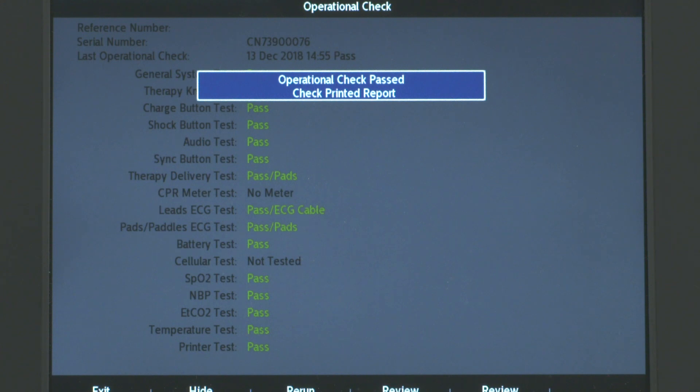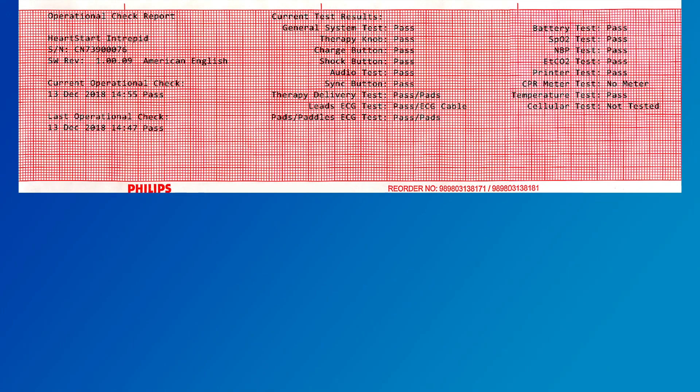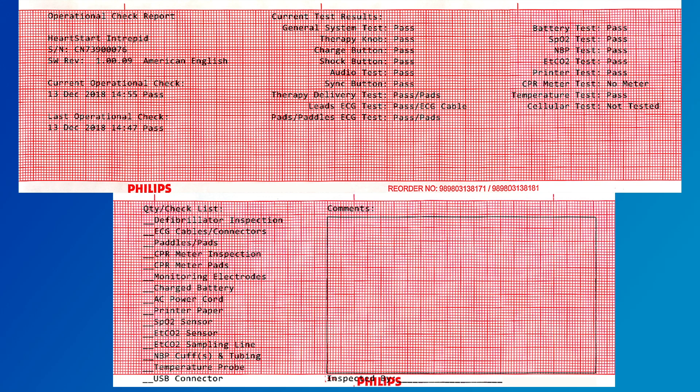When the Op Check is done, a report is printed automatically if configured. The first part of the report lists test results. The second part lists additional checks you should perform to make sure you have the necessary supplies and accessories in good working order. For details about these additional checks, consult the instructions for use.